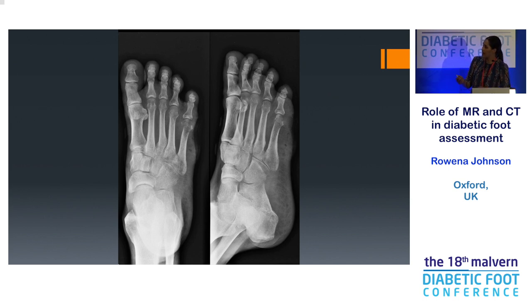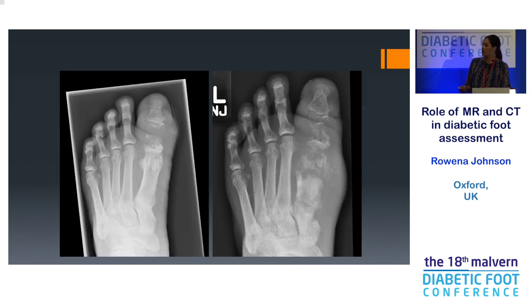You can see subtle changes at the fifth metatarsal head — the lucency and cortical destruction. On the oblique radiograph you can see soft tissue swelling, and little pockets of air in the soft tissue in the setting of infection. This more advanced example shows cortical destruction, osteomyelitis spreading into a septic arthritis, and the multifocal involvement of several bones with associated soft tissue swelling.